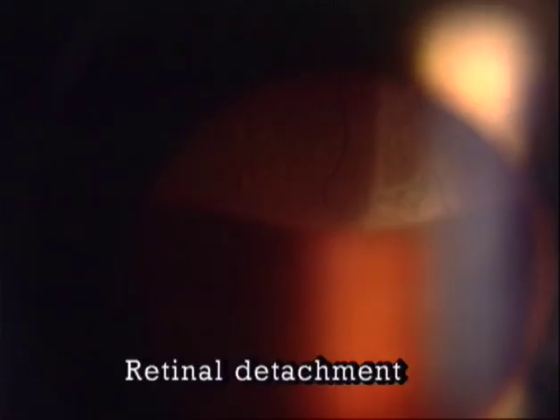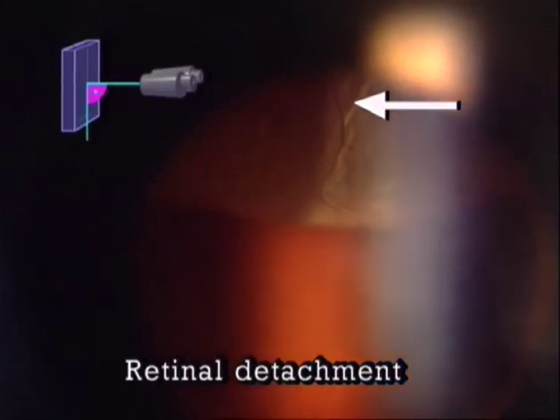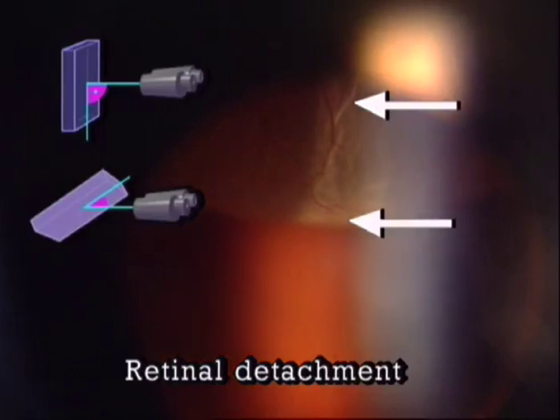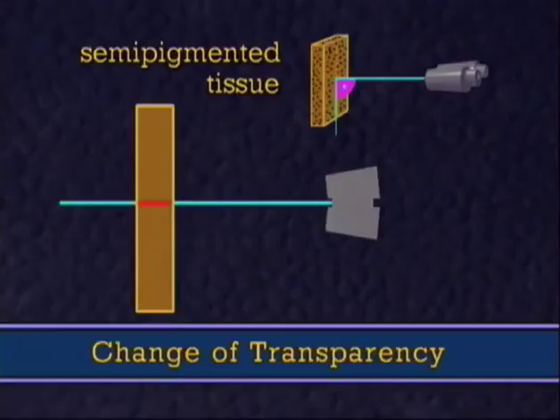This is shown here by the example of a detached retina. At the front of the bullous detachment, the retina is seen nearly perpendicularly to its surface, and therefore some dim red backlight from the fundus is visible. At the summit of the detachment, however, the retina is seen tangentially and therefore appears non-transparent and white. A similar phenomenon occurs in semi-pigmented tissue.